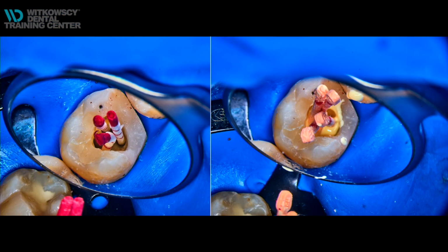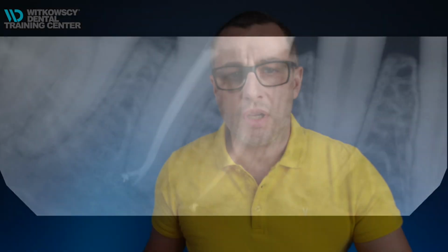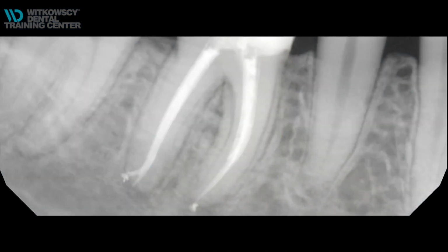So what happened? After drying the canal and obturation of the system, I saw something like this. Well, initially we can say, wow, we have 2 apices. We have 2 apices in the distal aspect. But unfortunately, it's not that way. Unfortunately, the problem is deeper than we think.